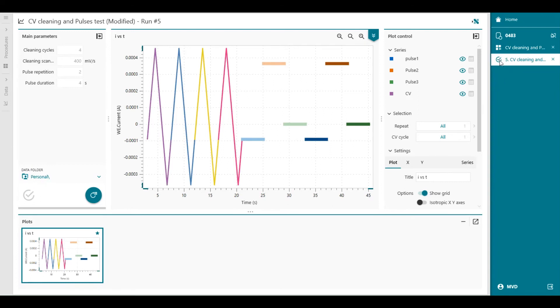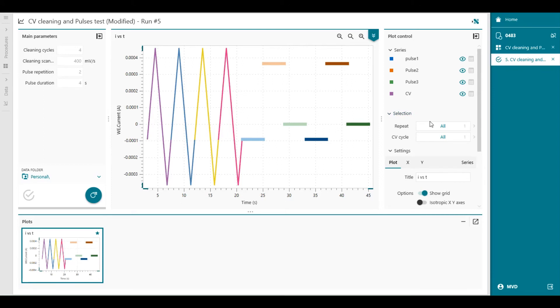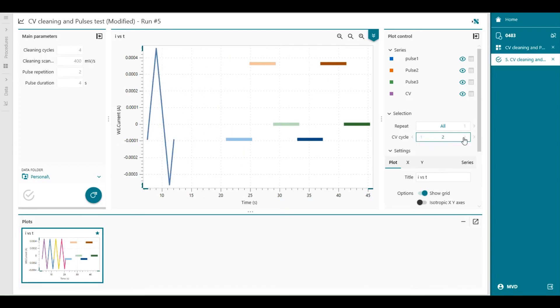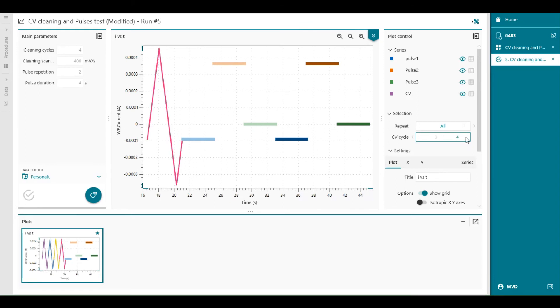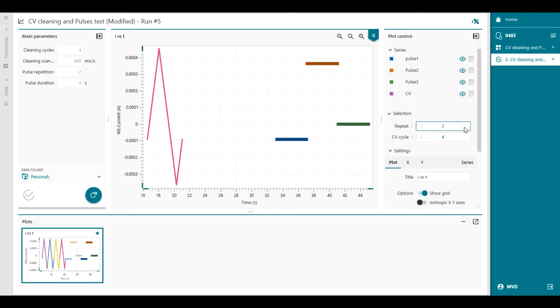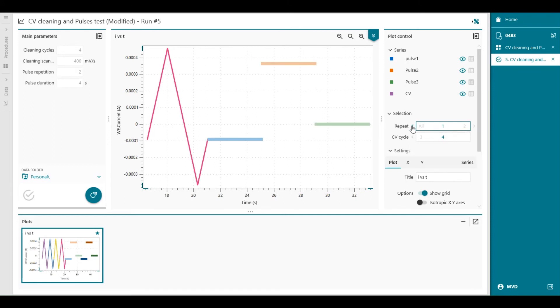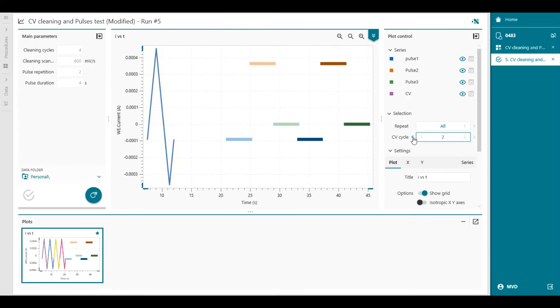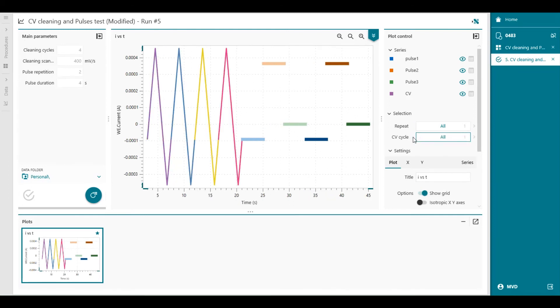You see a check mark in the data. And it's stored in the data folder. In the plot control under selection. This one here. We can also step through the CV cycles using the selector. For example, now you see all repeats and all CV cycles. But you can also select the first repeat. The second, the third or the fourth. And again, you can do that same thing with the repetitions as well. The first repetition or the second repetition. So you can select what kind of data you would like to show.